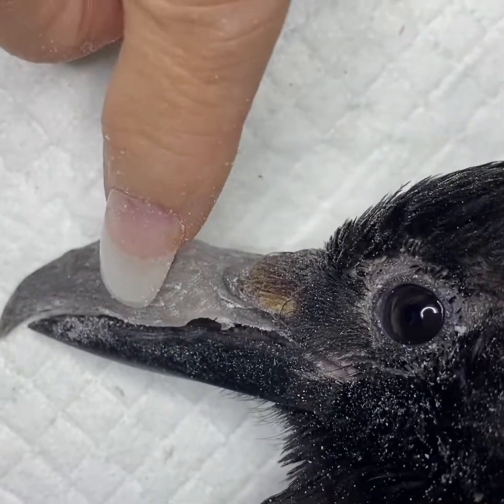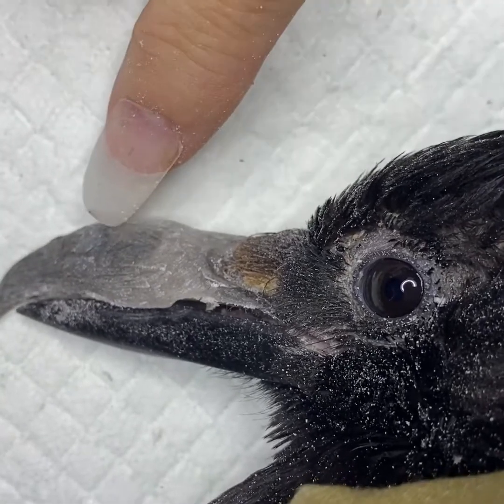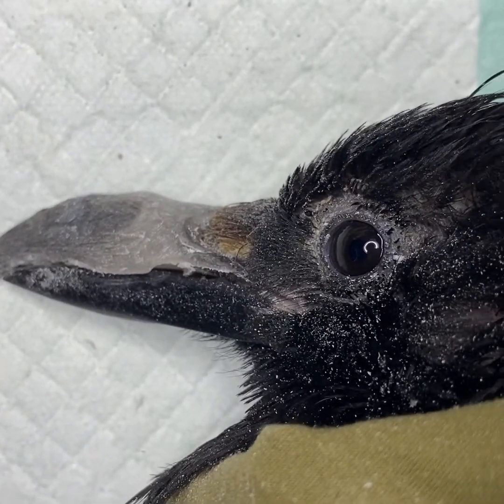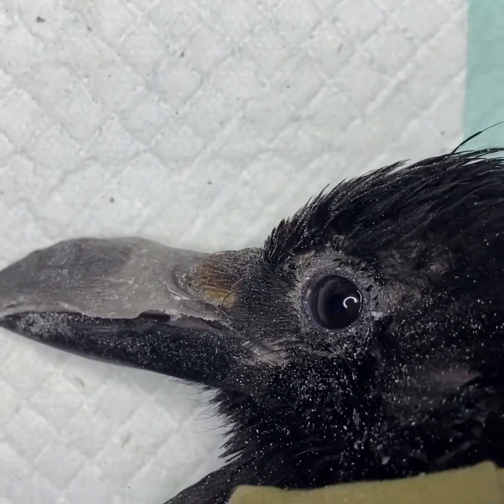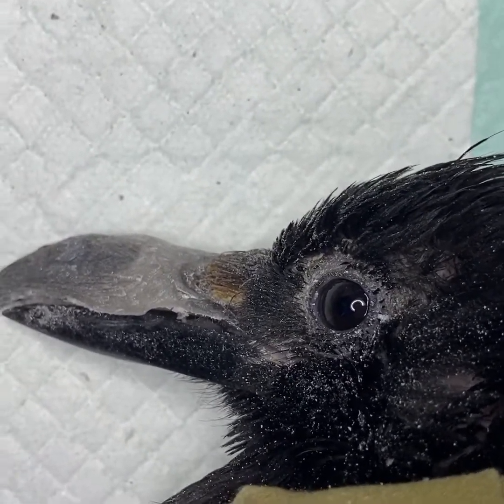A little reshaping right here, a little smoothing here and then the black acrylic to go over. It's not merely for aesthetics — it's also so that we don't want other birds picking on him whilst he's at school. We want him to look the same, and Corvids are very curious; we don't want them picking at his beak if it's a different colour than theirs.